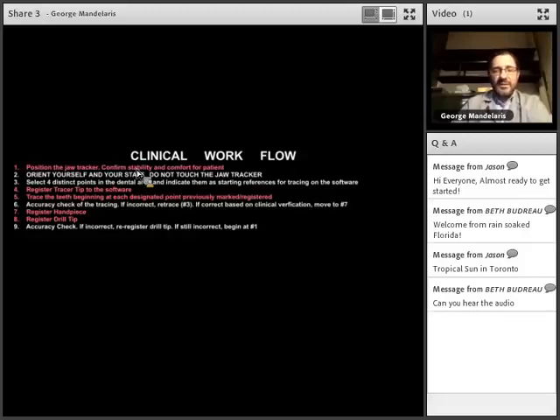If it's still incorrect, then we're just going to scratch everything and go back to number 1 and start the process over again. Again, garbage in, garbage out. All the accuracy builds on your history. So if you're not accurate at step 4 or 5, your problems are only going to compound as you go forward. So take the time and make sure that everything is correct from an accuracy standpoint before you start the osteotomy site preparation.